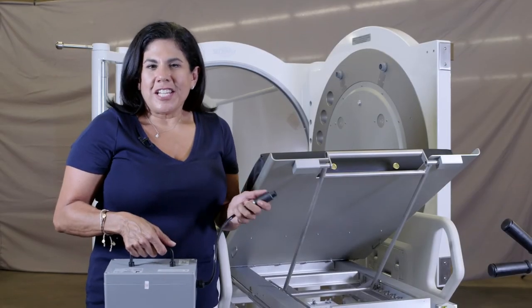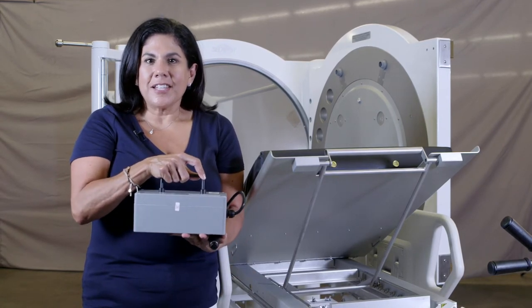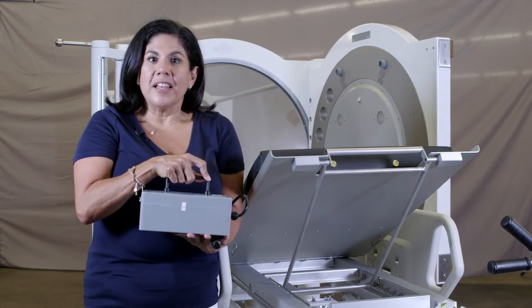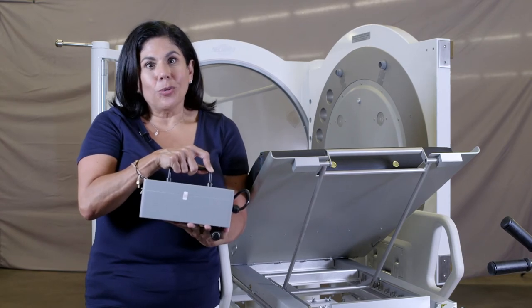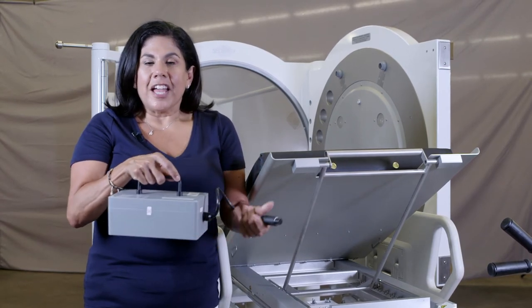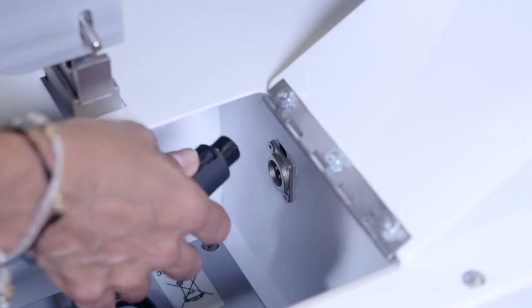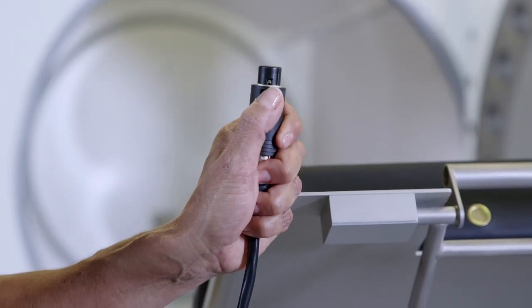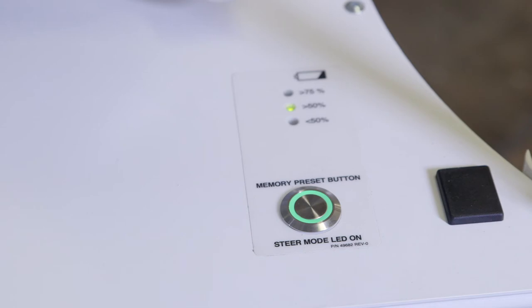When you receive your Seacrest eGurney wheeled stretcher, you'll also receive two batteries and a battery charger. We recommend that you always have one battery charging somewhere else in the room and one will obviously be in your wheeled stretcher. It comes with a plug that easily slides into and out of the receptacle. Always remember, use the tab when plugging in or taking out your battery.